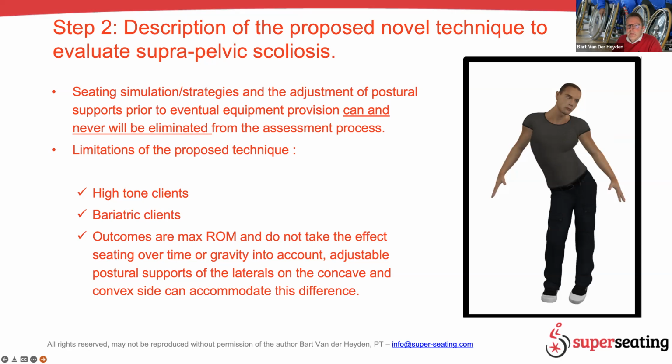We are not looking with this technique to eliminate the fitting and the adjustments when you are eventually prescribing or when you have the final equipment. That will never be eliminated. I think we still need some trialing phases, but I think it will help you to already have the right direction for the seating intervention and have accurate data. But I just want to make sure that the expectations are not too high, although they should be high.